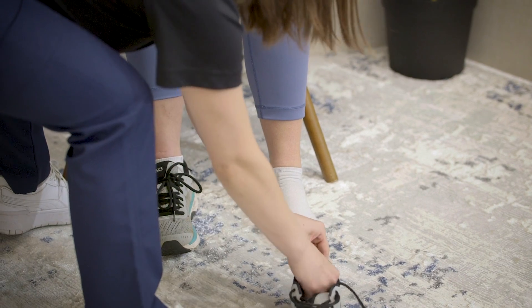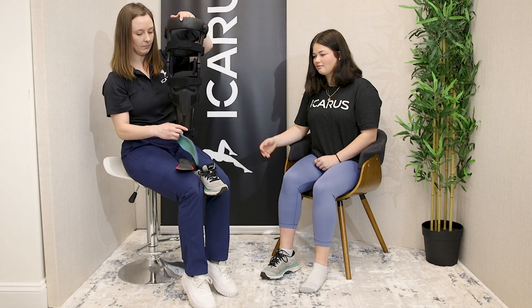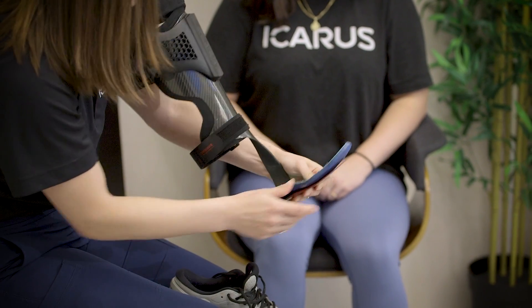Ensure the patient is comfortable and in a good position, wearing suitable clothing for the fitting. To ensure a proper fit and assessment, measure the patient's leg. Note any key anatomical landmarks, such as the medial and lateral epicondyles, mid-patella, or malleoli.